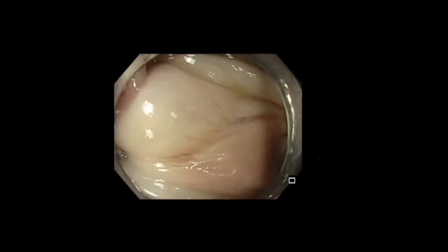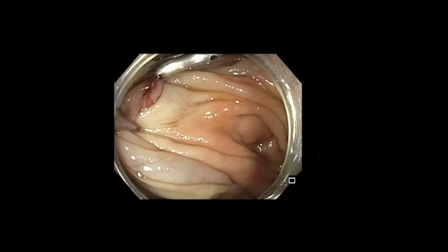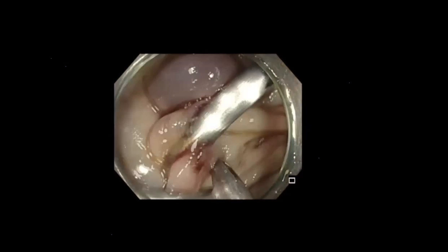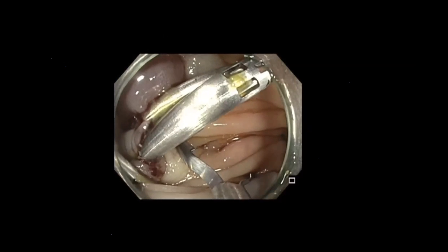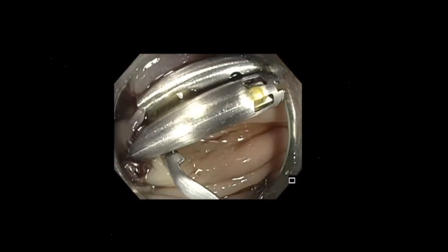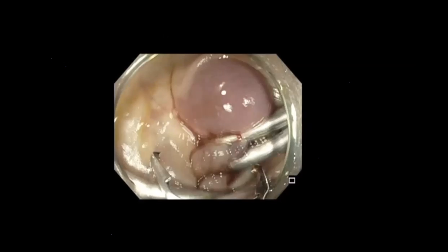All I saw was a little bit of bulge that made me do all of this, assuming that there's a big feeding vessel. But when I was preparing for this talk and going through this video, I recognized that big feeding vein. If you want to check it out, this video is on YouTube. You can go back and check that vein, you could see that.